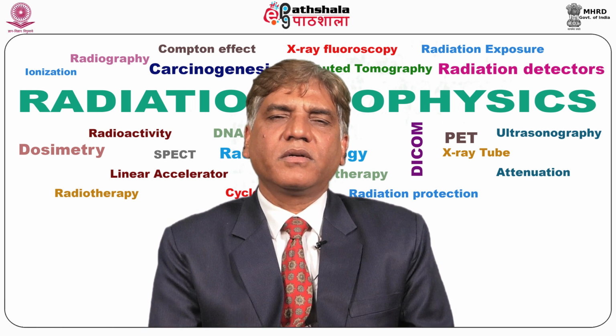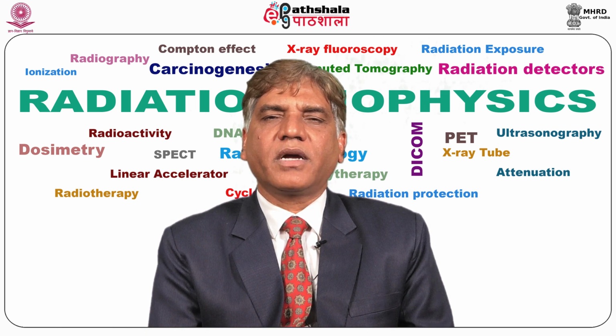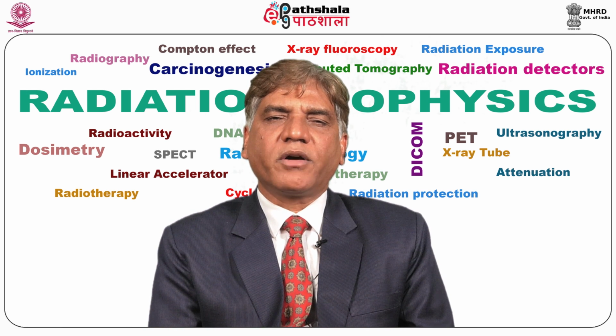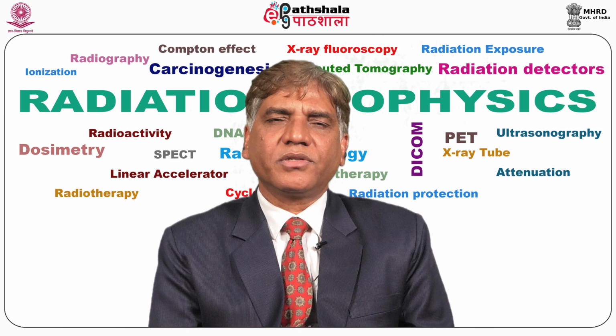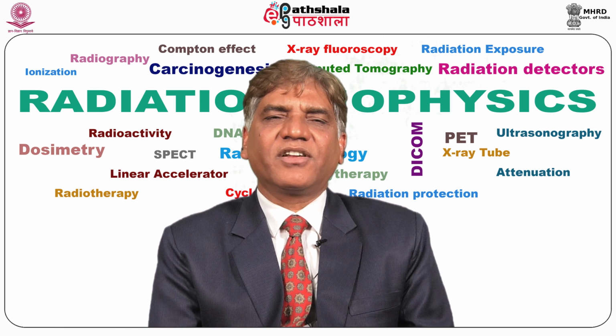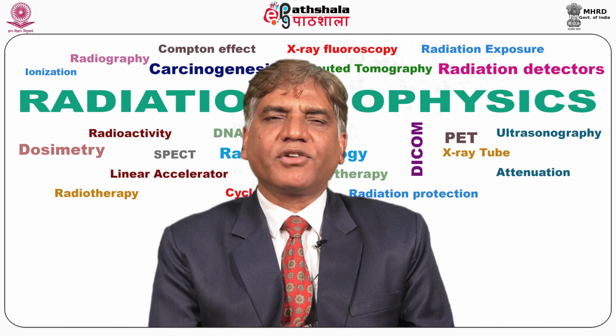Then we need a server. An archiving server is composed of a database server or image manager, short term and long term storage, and a computer that controls the PACS workflow. Third is the display. Finally, to display the digital image, a viewing component is required as a workstation, and another component of PACS is teleradiology, which is defined as the ability to acquire a diagnostic image at one location and review it at a remote location.